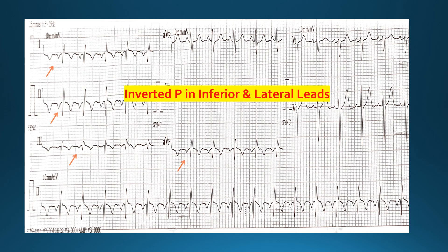Look at the P waves in the inferior and lateral leads as well. We can see, as shown by the moving arrows, that these P waves are inverted. These are the same leads in which we are seeing the other findings of the Q waves, ST elevation, and T wave inversions. These inferior and lateral leads are definitely those involved in myocardial infarction.